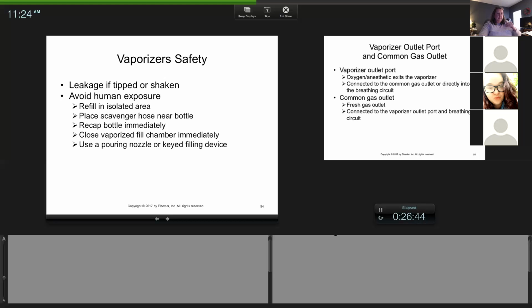But definitely have to tell somebody. When you fill it, ideally you have an open air environment, but most of the time we're in a closed room. You just want to close it fairly quickly and cap your bottle. Again, if you forget to cap your bottle and you set an empty bottle on the counter, it's going to be gone. And one thing I neglected to mention when I was talking about the individual anesthetics is that SEVO is more expensive than ISO.